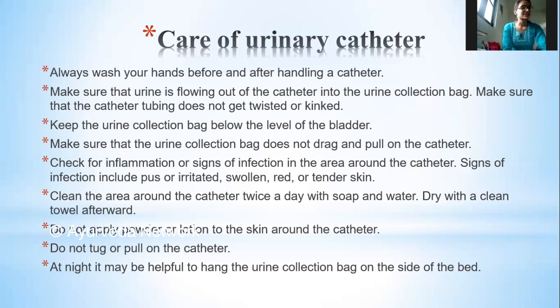And we were discussing the care of the catheter. Again, after washing your hands and everything, how do you have to clean the catheter? You must clean it at least twice a day with simple soap and water. How are you going to do it? You're going to take a clean bucket or whatever tumbler you are using, or you can even do it with a wet sterile wipe.